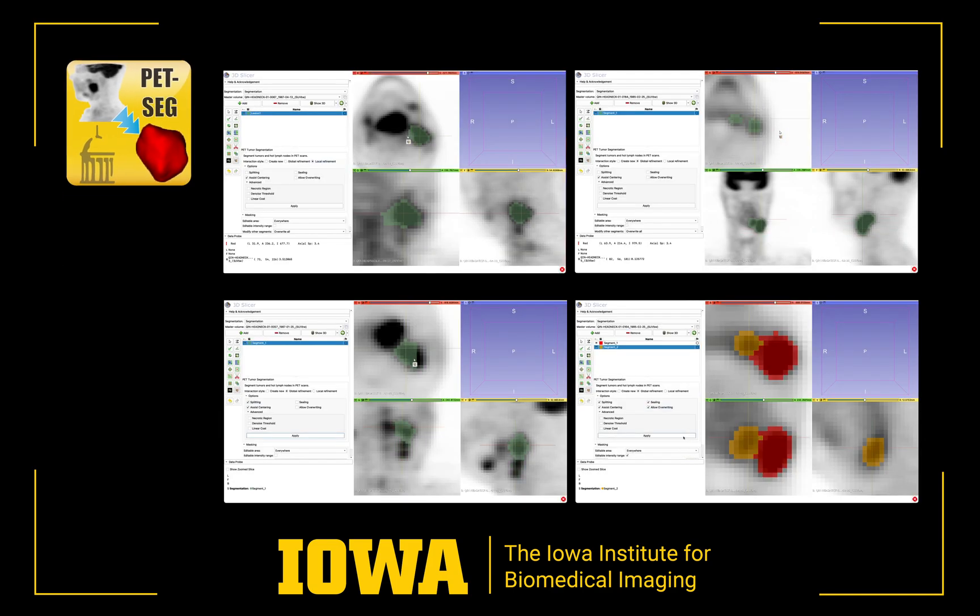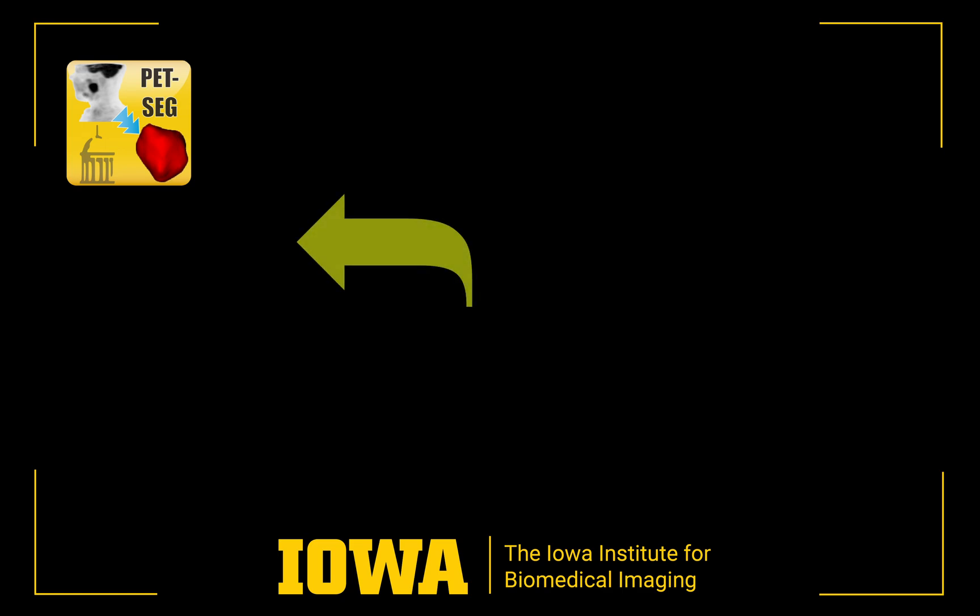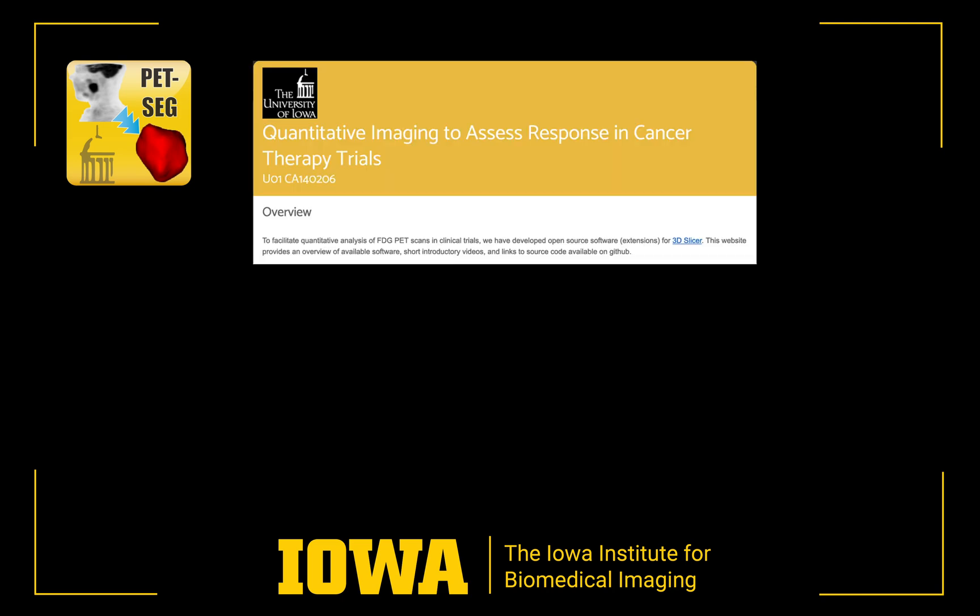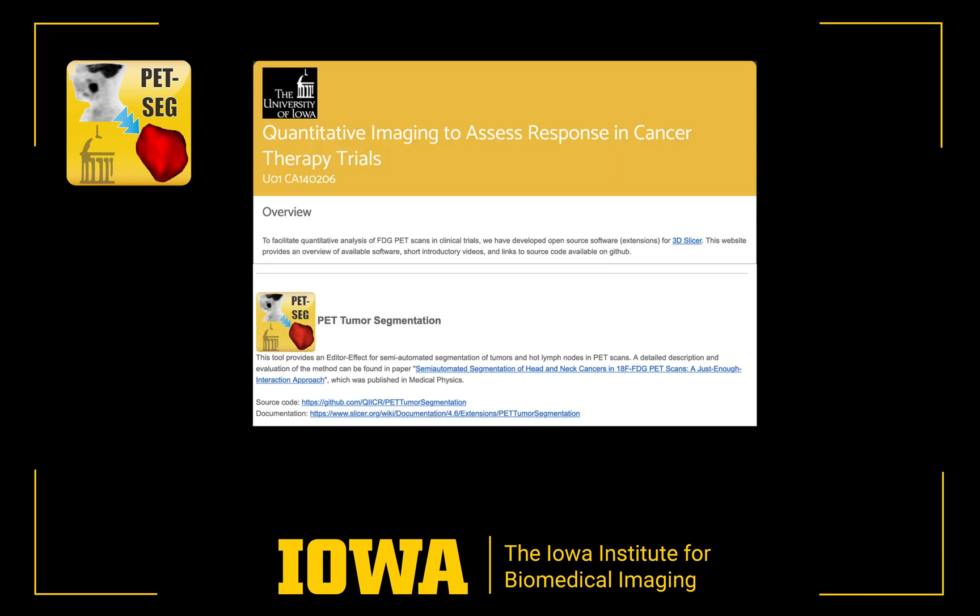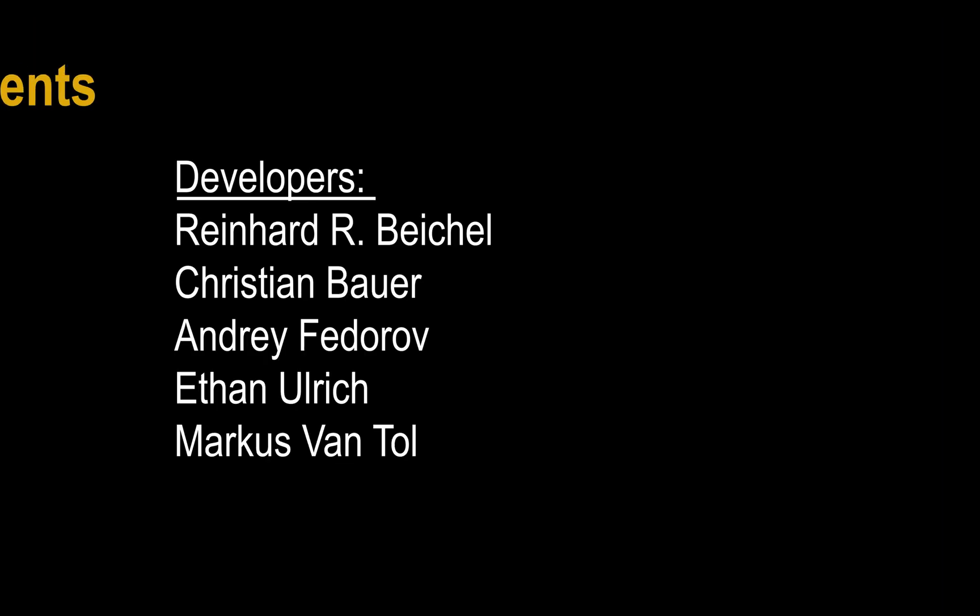To know how to best approach segmentation of lesions in challenging situations requires some user experience. The tool supports undo and redo to try different approaches. For a more complete description of all available options, see our paper and our website.